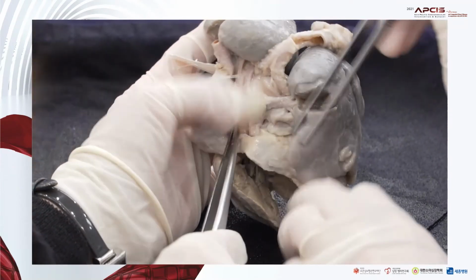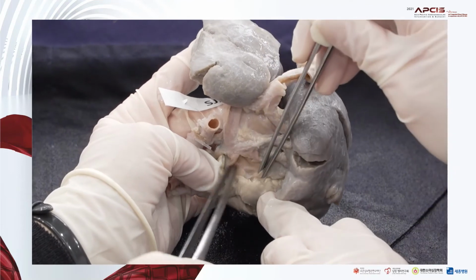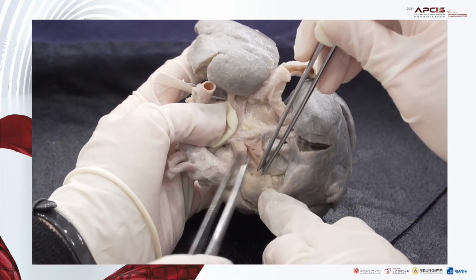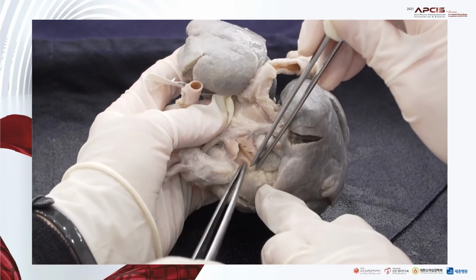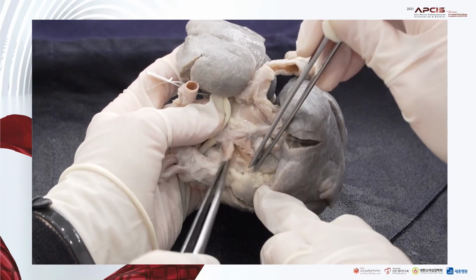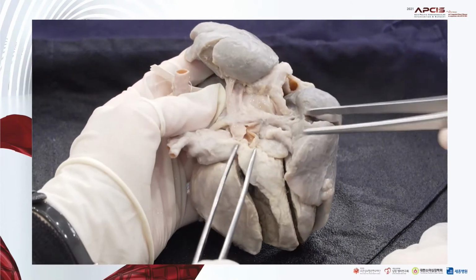Okay, let's see from the top. So I think the pulmonary trunk is present, but at the pulmonary valve level, there was no opening here. So it's also pulmonary atresia.